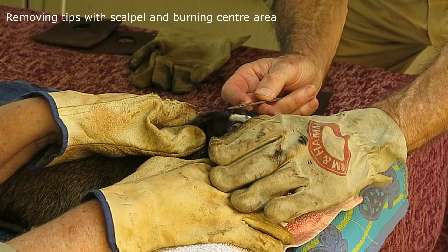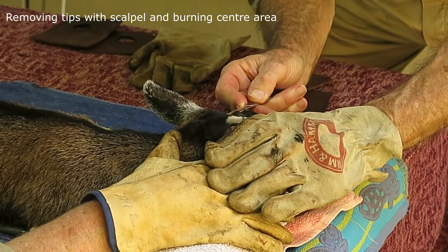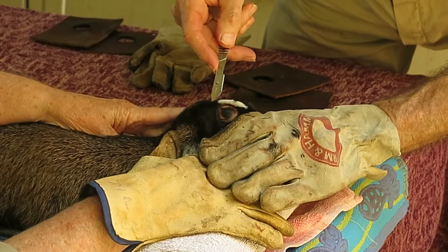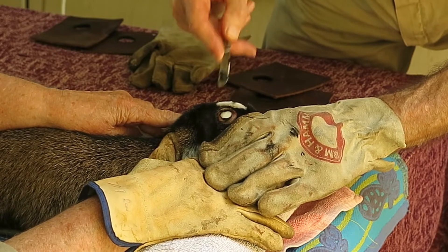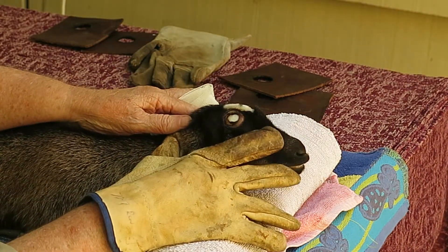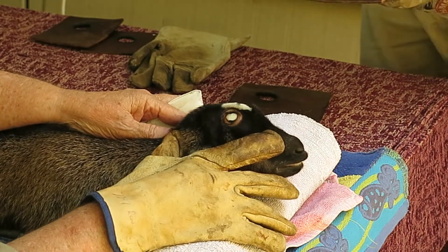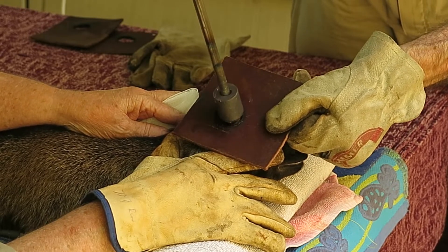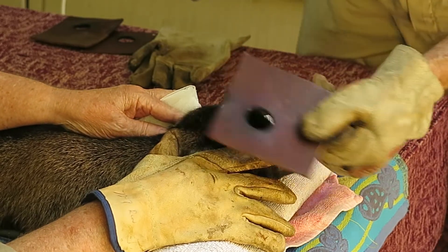The middle has to be removed with a scalpel blade. Swabs are ready in case of any bleeding.